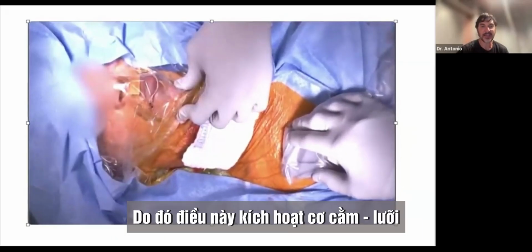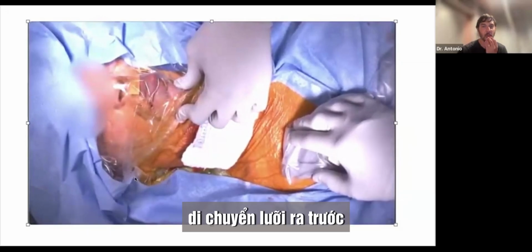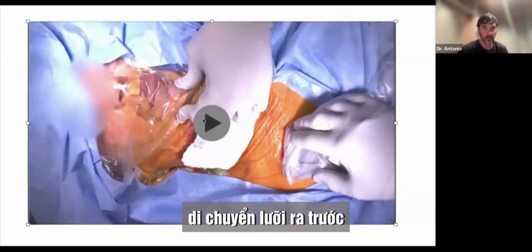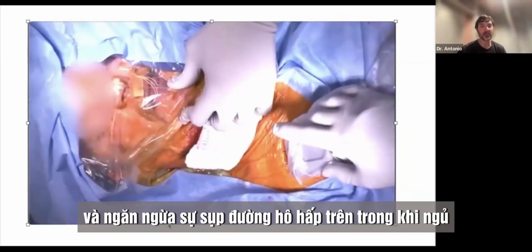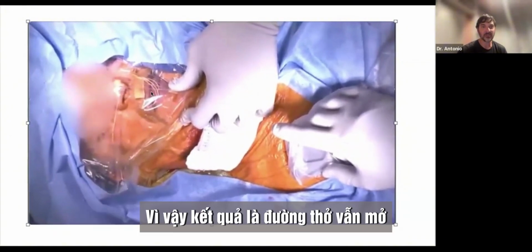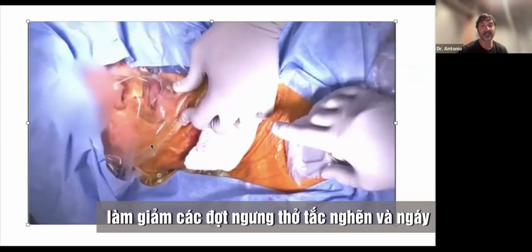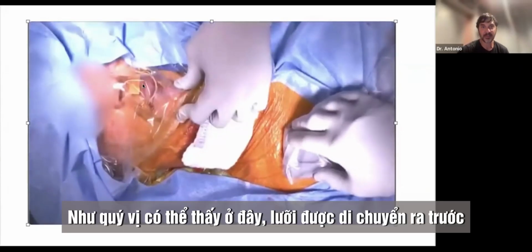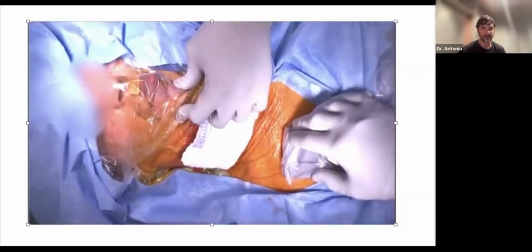So this activates the genioglossus, as you can see here, and other tongue protrusor muscles, moving the tongue forward, I will show you again, and preventing upper airway collapse during sleep. So as a result, the airway remains open, reducing obstructive apneas and snoring. As you can see here, the tongue is moved forward during inspiration.